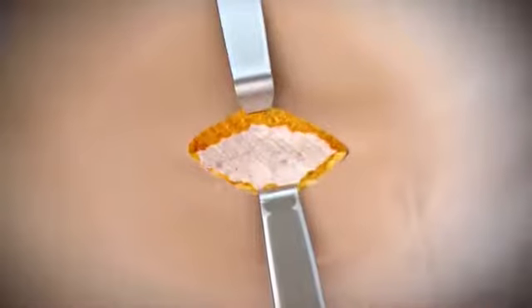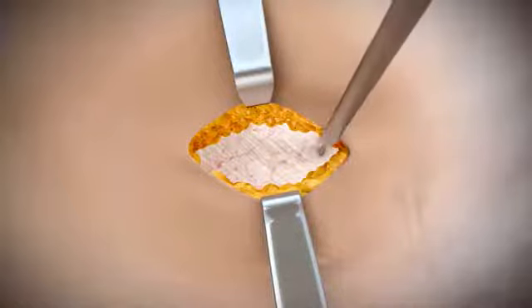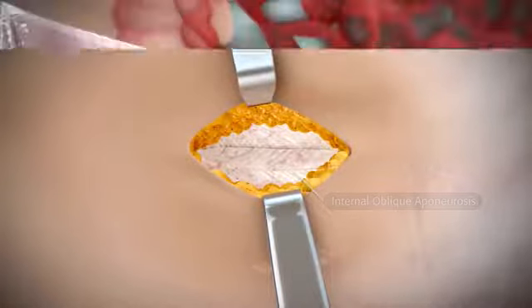Using diathermy, open the aponeurosis, exposing but not rupturing the underlying internal oblique aponeurosis. This will ensure the correct tissue plane is identified and maintained.